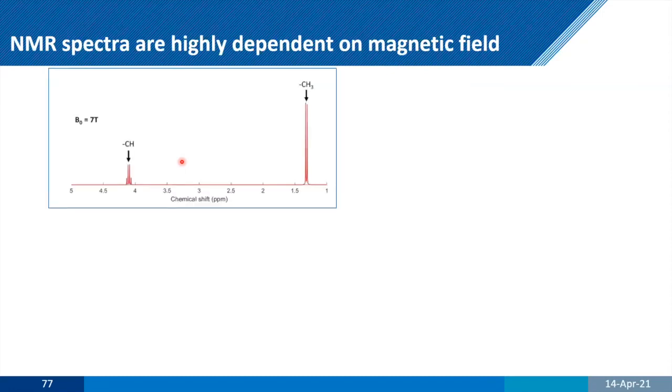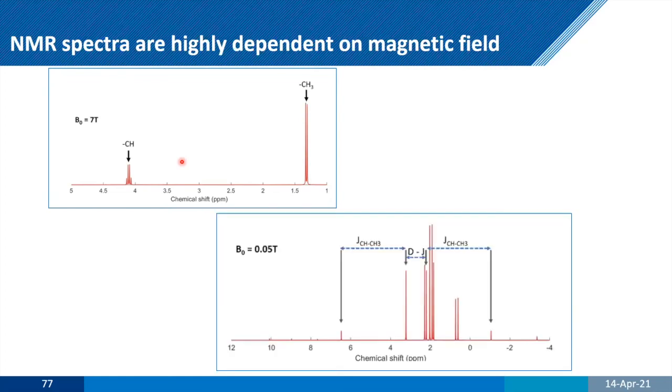Well, again, what we start off with is looking and saying, what would a high resolution spectrum look like at this field strength? So here's a standard. If we look at lactate, for example, we have a quartet and we have a doublet from the CH3 and the CH at 7T. What would that look like at 50 millitesla? And the answer is completely different. This is what is called strong coupling, because our delta chemical shift here is comparable with our scalar coupling. And that means the spectrum becomes a lot more complicated, but there are a lot more interactions between those. So that's kind of interesting.